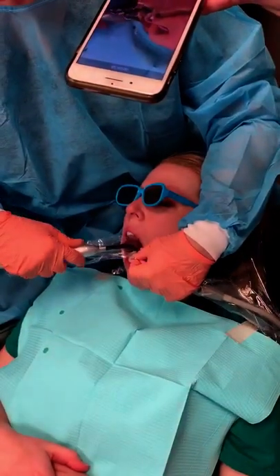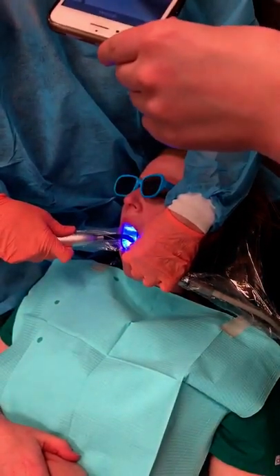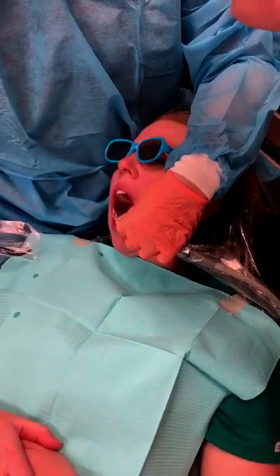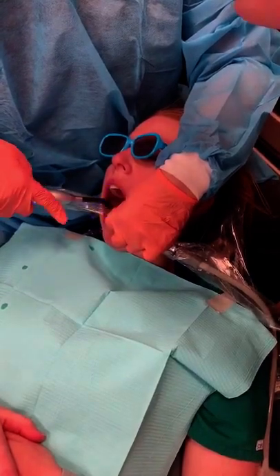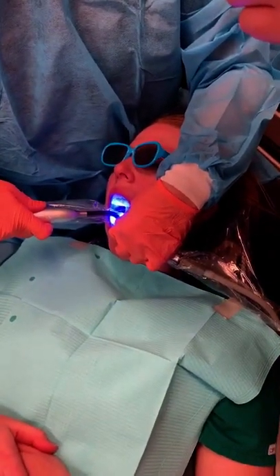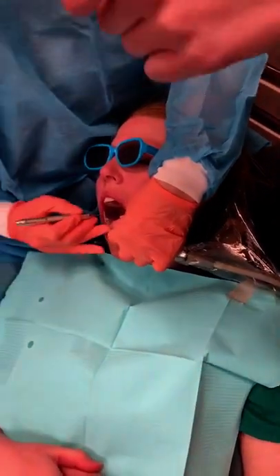Regardless of what teeth you're doing, it has to be at least 30 seconds. You can change the time on most curing lights — apparently this one is set at 10 seconds. I'm going to check that because this is a fairly thin sealant anyway. I'm just going to check if it's a little tacky.